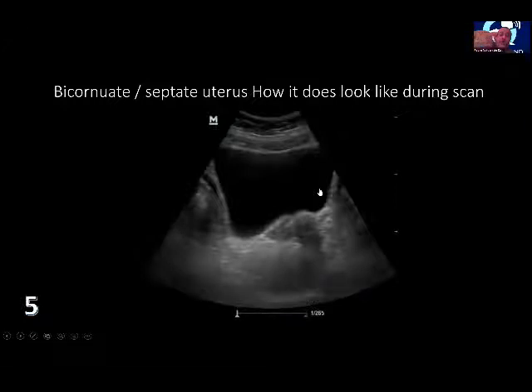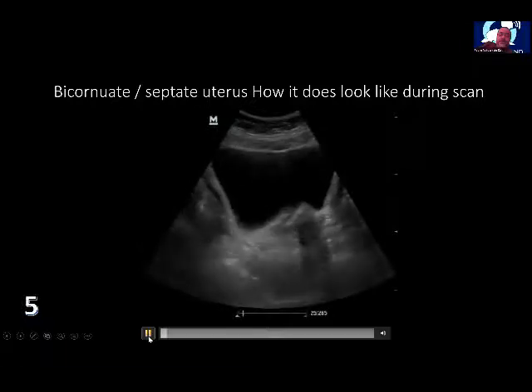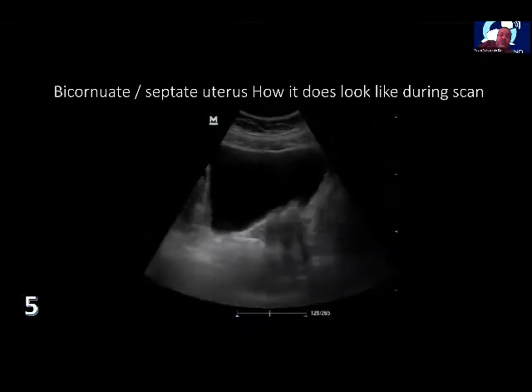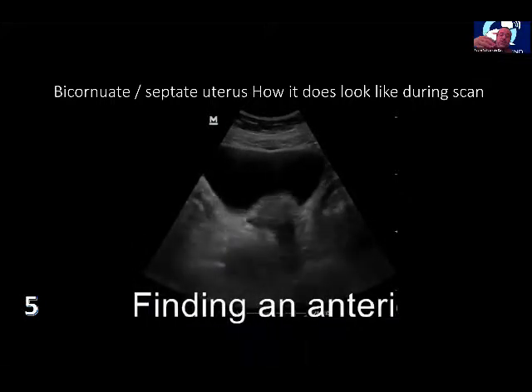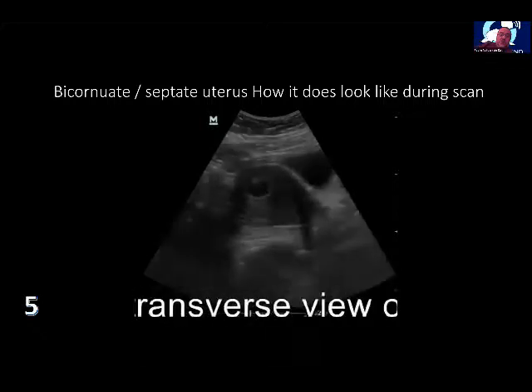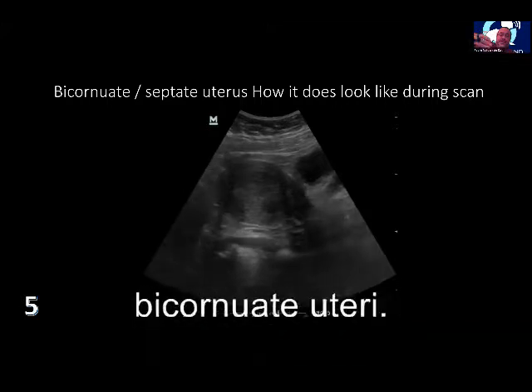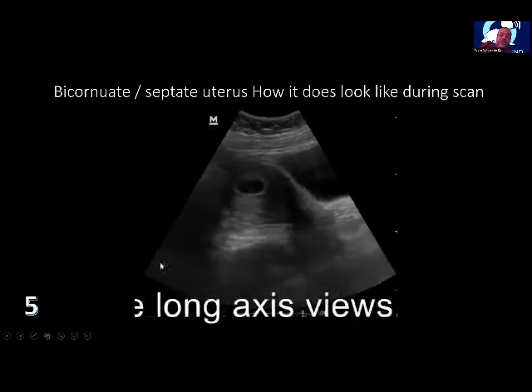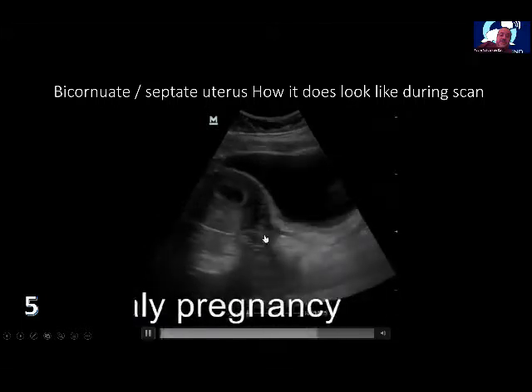How do we look at that in real time? If we scan from the pubic bone upwards, tilting the transducer more than moving the transducer, we can see that kind of image. That's a transverse view and that's a longitudinal view.